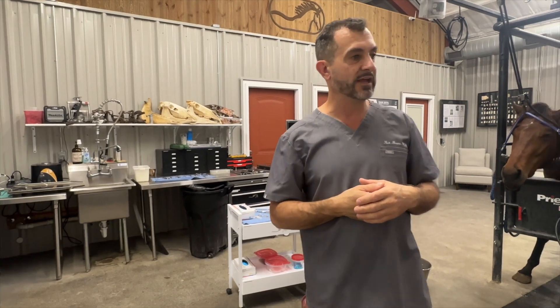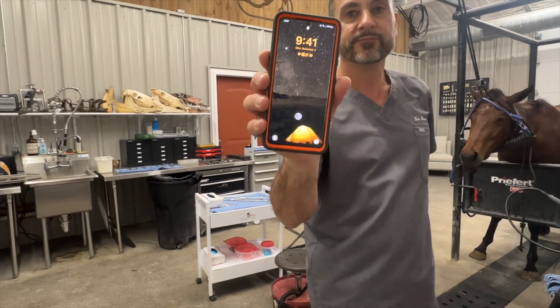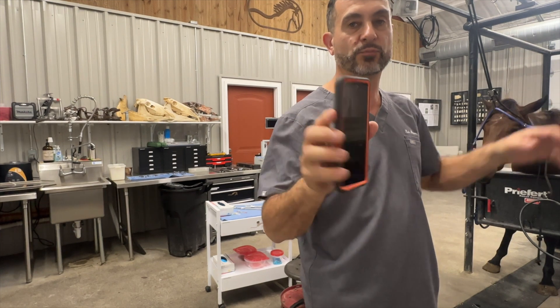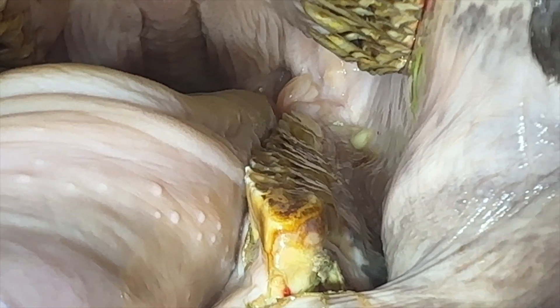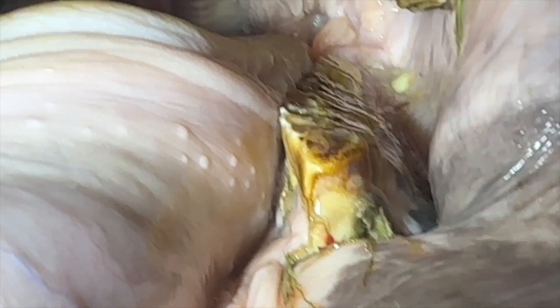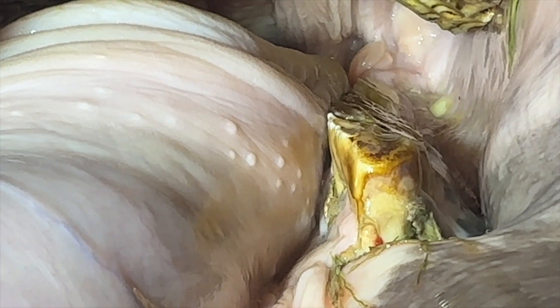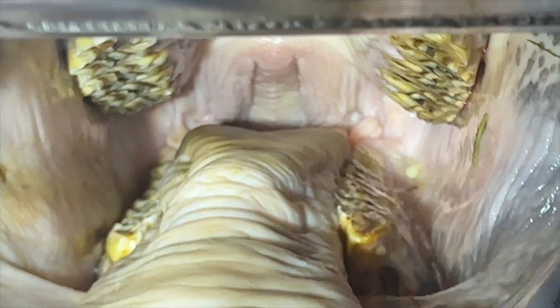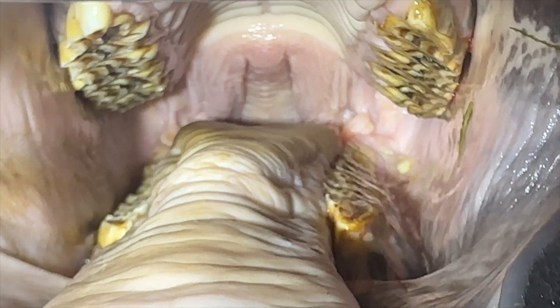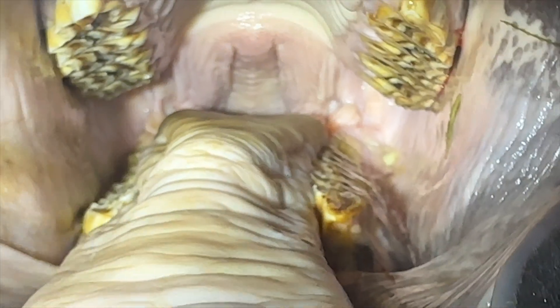We can show you the time — it's 9:41 and we haven't started the procedure yet. Looking at lower six, it's very infected, and we have a cap, so we'll have to remove the baby tooth and then grab the tooth underneath. The horse's left side is much steeper, meaning he hasn't been eating on that side because it hurts — that's a shear mouth due to pain, which should resolve once we remove the bad tooth.